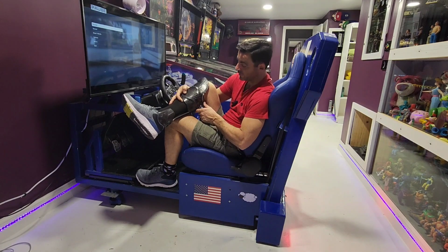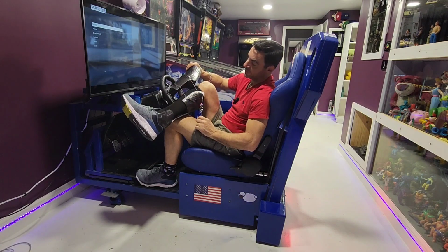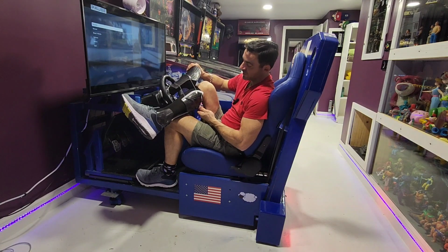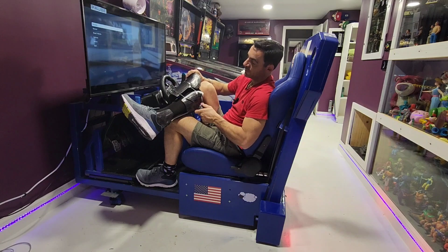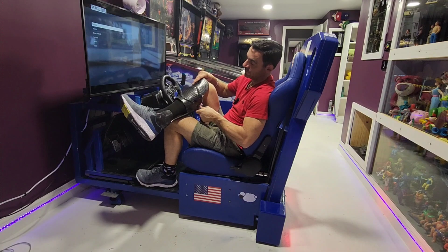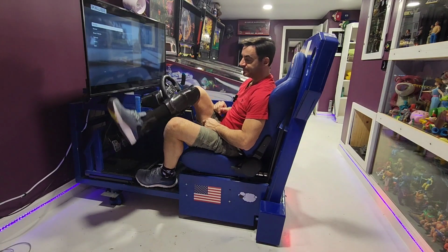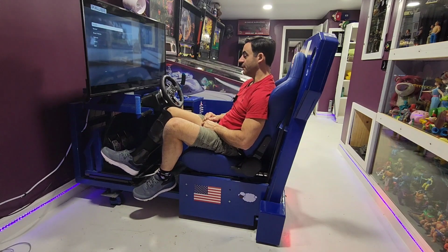It's not hard to remove. You just pull the lever on the back. That pulls out like that. Then you can slide your foot out. And then you push that in. And as you do this, it's just a ratchet. It just winds it back to clamp your leg in place. So it'll take me a couple of minutes getting in and out of the car just to get the thing set back up again. The hardest thing is getting your shoe on and off. But yeah, driving, and I'm calling it an appliance, a brace, whatever you want to call it.